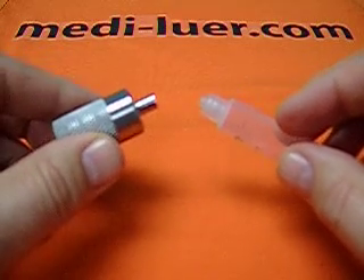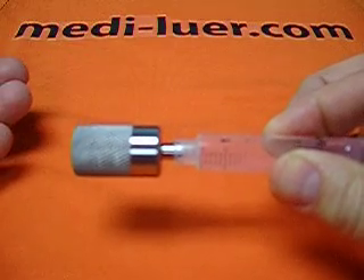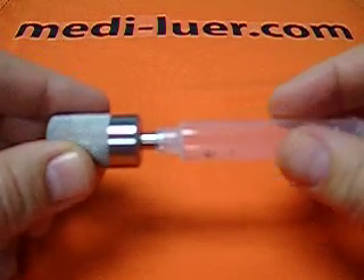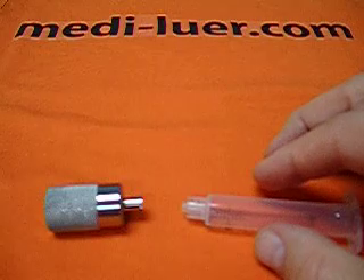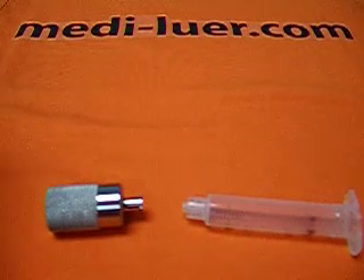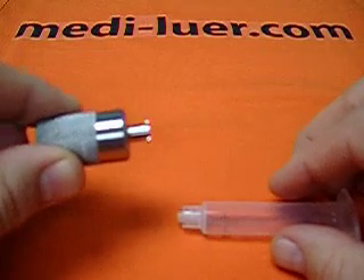You use the reference fitting attached to the part to then do another test on the fitting. If the fitting passes that test, then the fitting is good according to the standard based on those parameters. The standard has several different tests: stress cracking, liquid leak, air leak, separation force, ease of assembly. They go down a list of tests that you can do, and you need the reference fitting to do those tests.